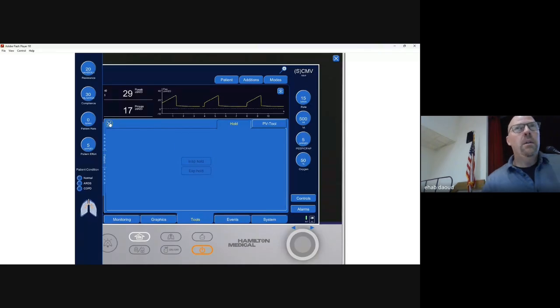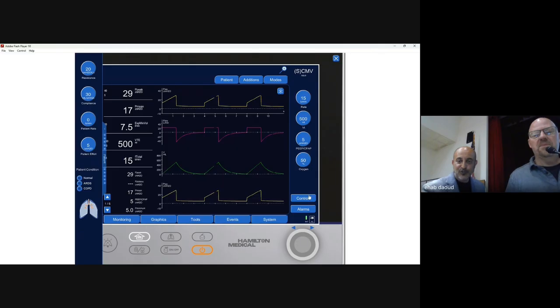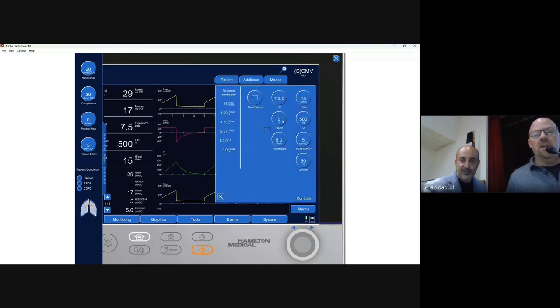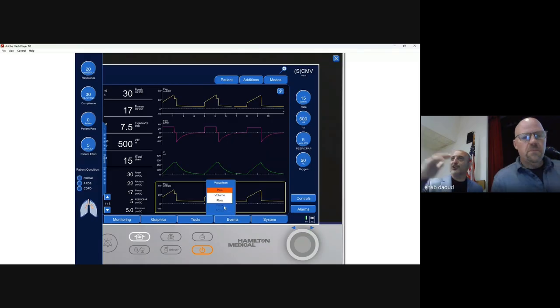So that was an interesting dynamic that we showed you, what we thought the simulator would do. It's not doing it. So we can't do the inspiratory hold in this simulator. So yeah, I'm sorry about that, my mistake. But what we can do is go to the controls and put a hold. There you go. I think it should work. Let's try it. Okay, so it's not a total hold.